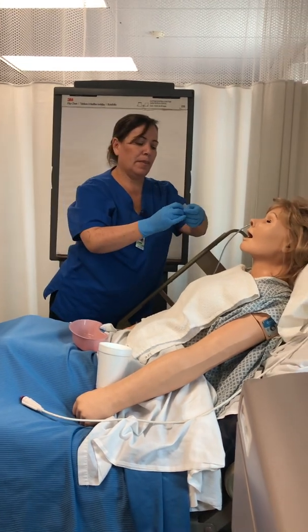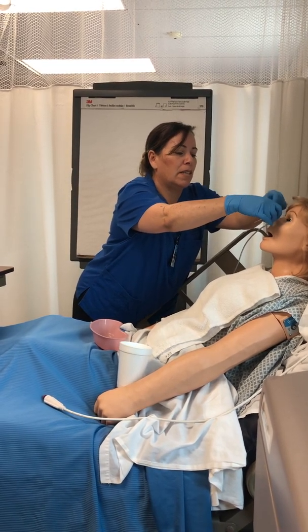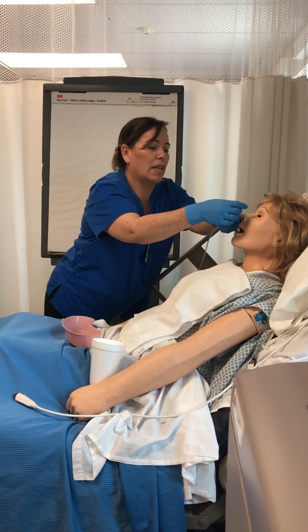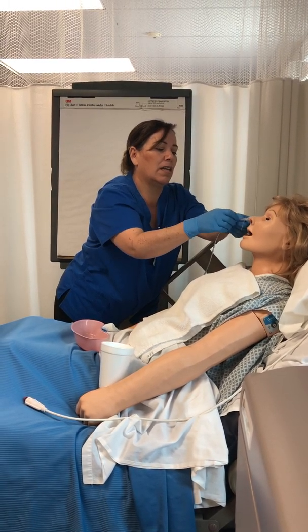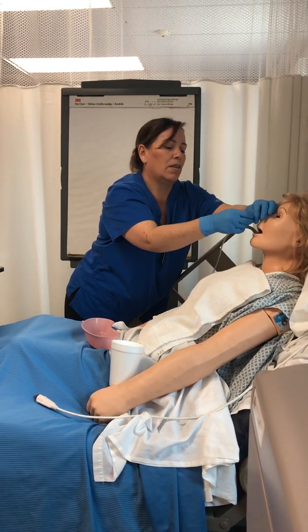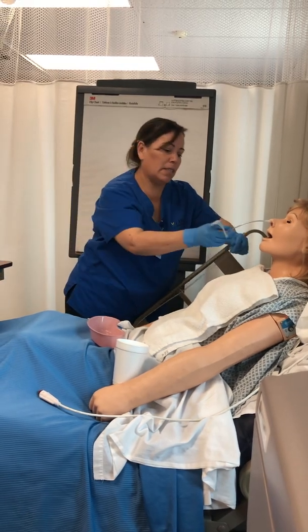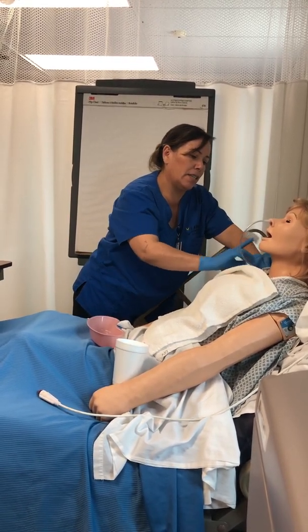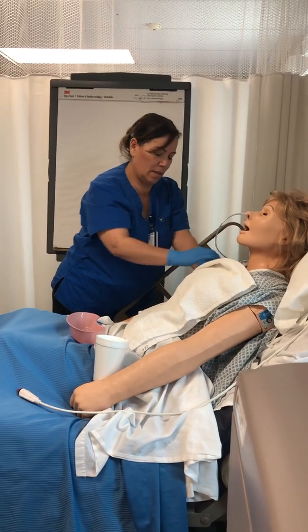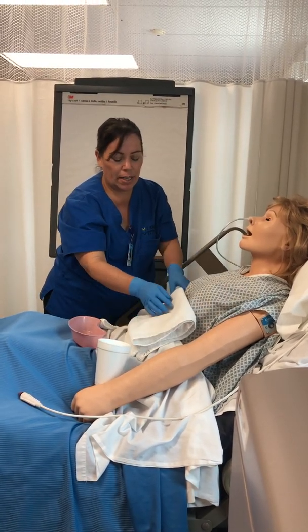to tape it. So I already cut 3 to 4 inches of the tape. Then you put it on top of the tip of the nose, and you tape it in the opposite way. Then you give enough space for the patient to move his head, and then you tape the tube on his gown. And then you take this out.